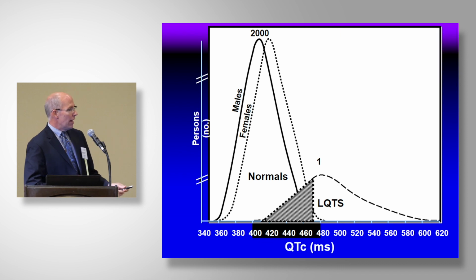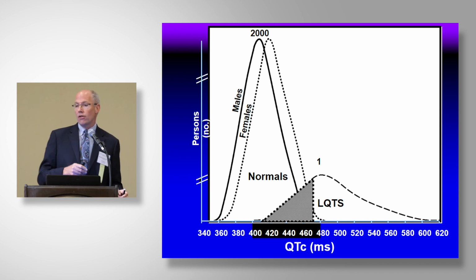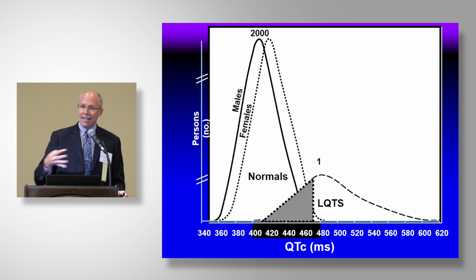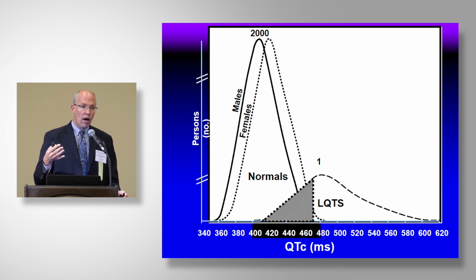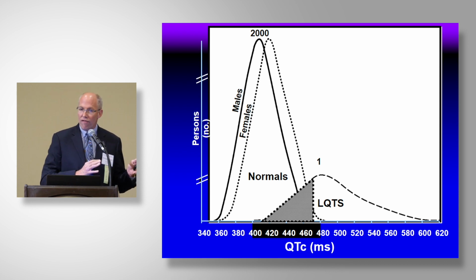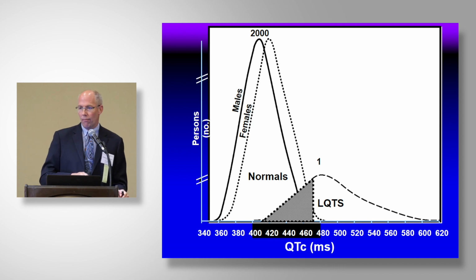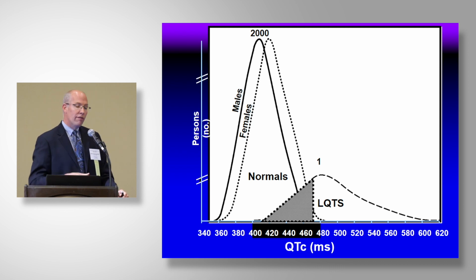and you need to try to get them under 500 as best you can. From a diagnostic standpoint, we have this problem, right? I showed you that ECG. QTc perfect, 415, but she has long QT type 1. This is that subpopulation, which isn't so small, of normal QT interval long QT syndrome, for which about 40% of all long QT people live there. But that's okay because most of those who live there are the asymptomatic family members. That's not who we're needing to catch with a screening program. We need to catch those who might do events rather than those who just need to avoid Zithromax.